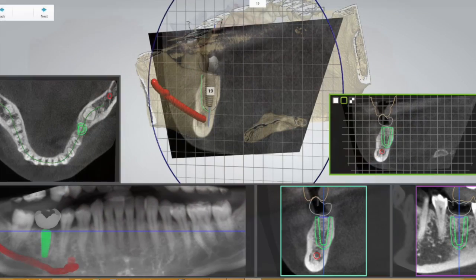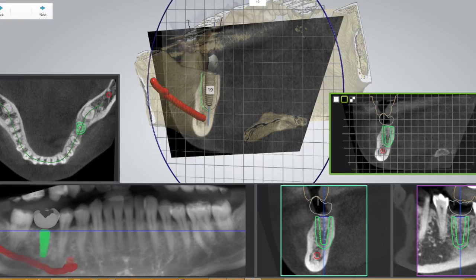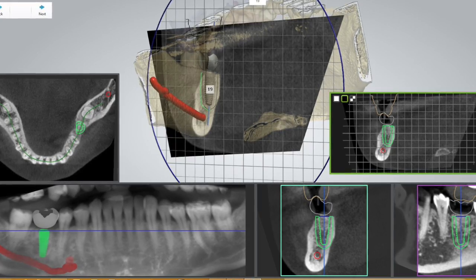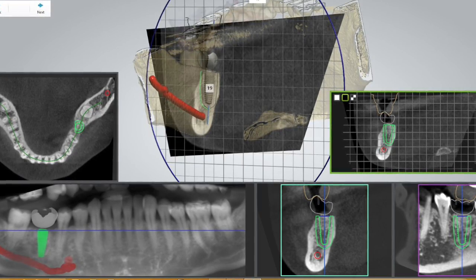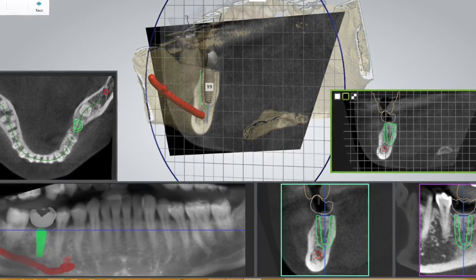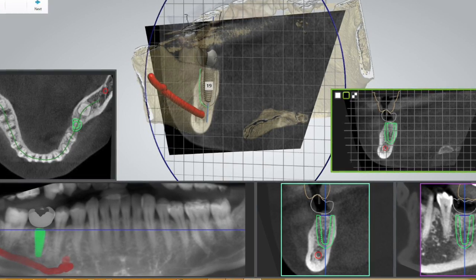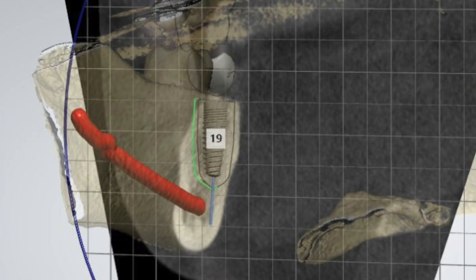With the virtual restoration in place, we'll then place a corresponding dental implant and align it perfectly according to the position of the restoration and the amount of available bone. We can select the exact implant type, diameter, and length of the implant at this time.